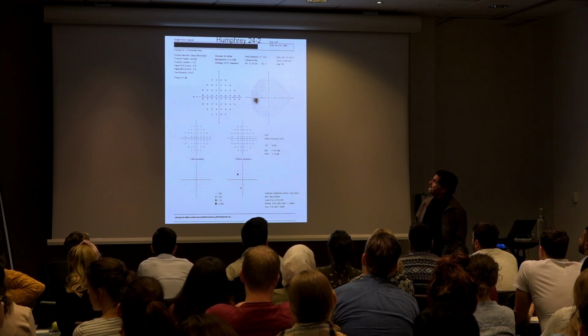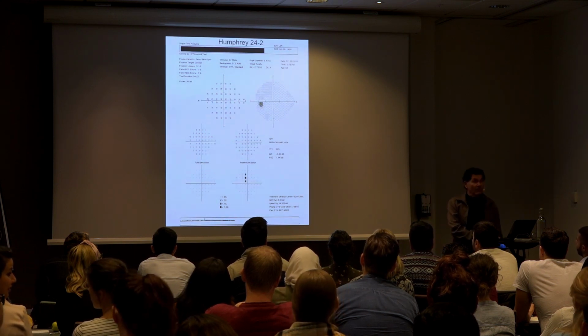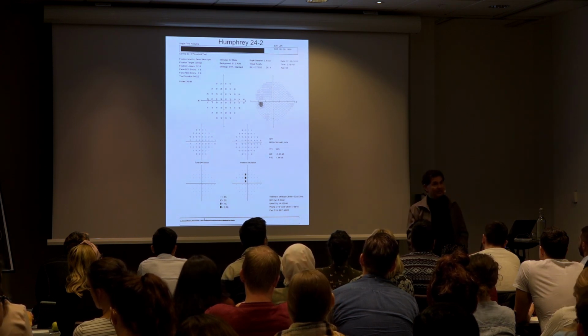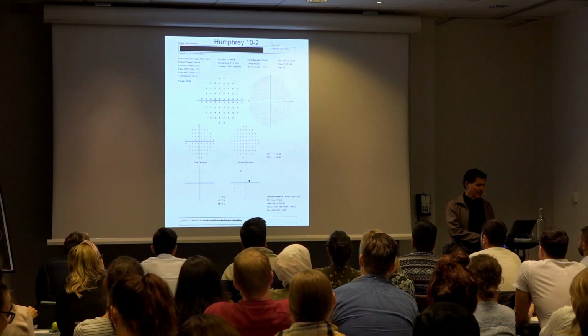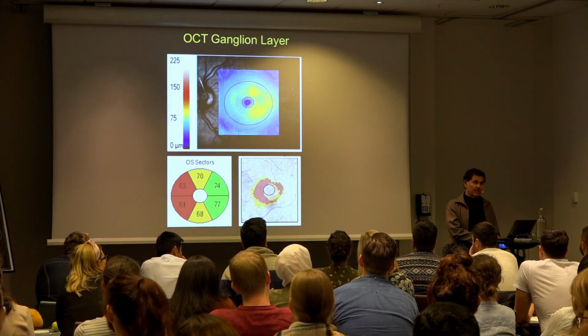The 12th of August. And the previous one? A month before. Well, in glaucoma, you see this all the time, fluctuation. So it's a behavioral test. It's not going to be the same every time. But he didn't have any other symptoms. No, he was completely asymptomatic.